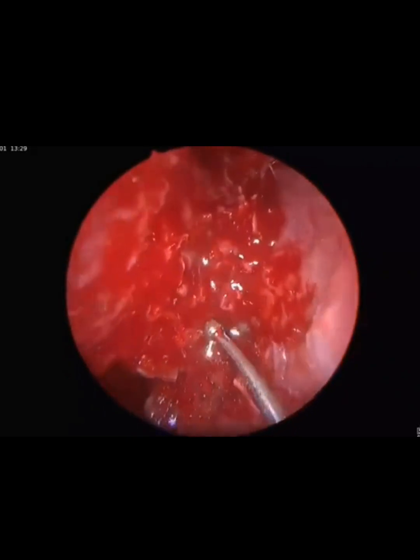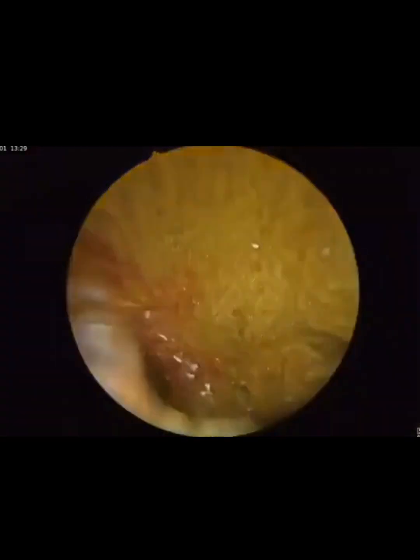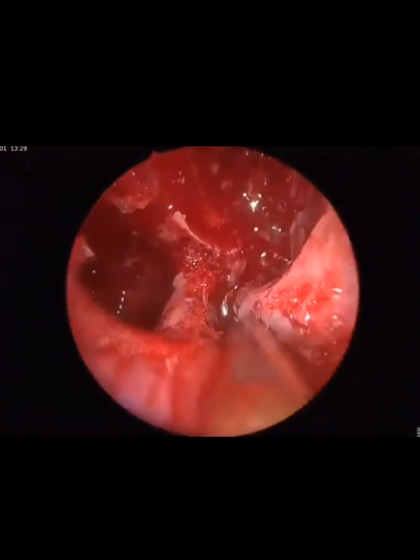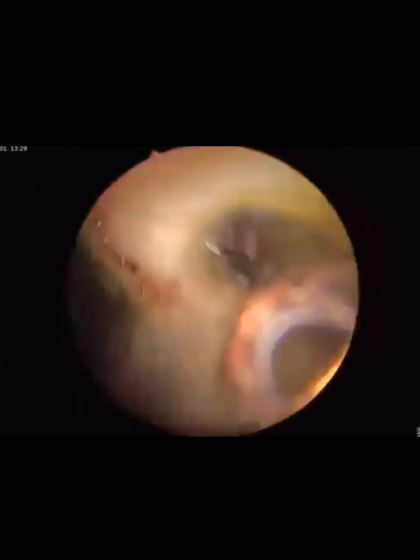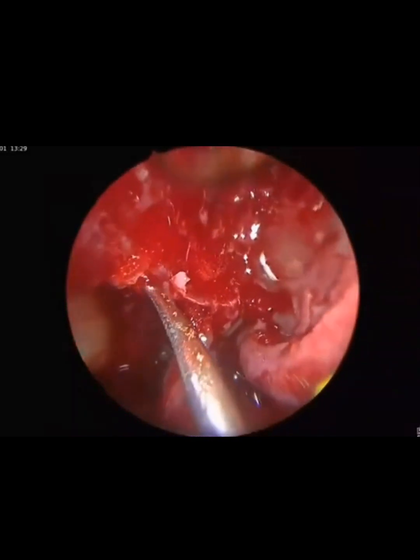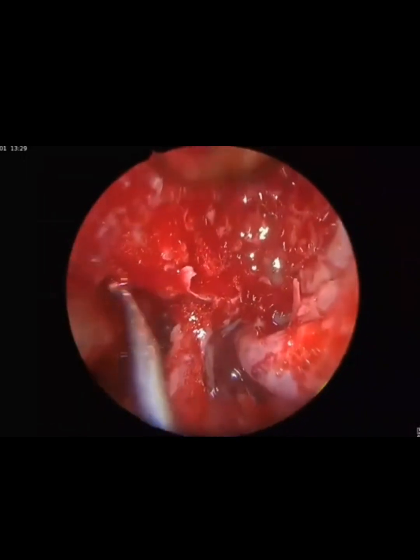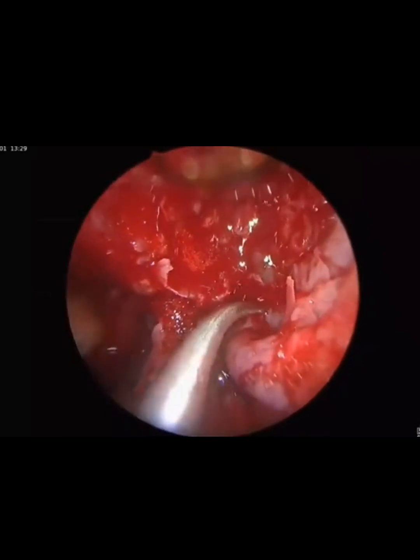Now I am going to pierce the lamina and enter inside the posterior ethmoid, inferiorly and medially. Now what is the landmark? The landmark is the maxillary sinus upper border. We have to stay inferior to the upper border to seek the sphenoid sinus. Okay. So always keep in mind the upper border of the maxilla. We have to search for the sphenoid sinus here only. Okay.